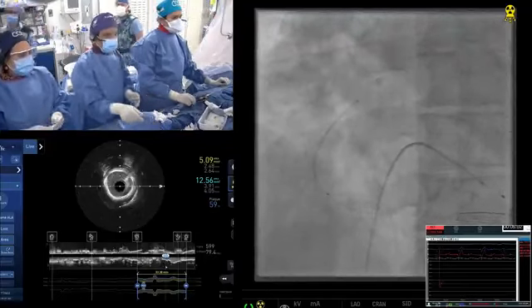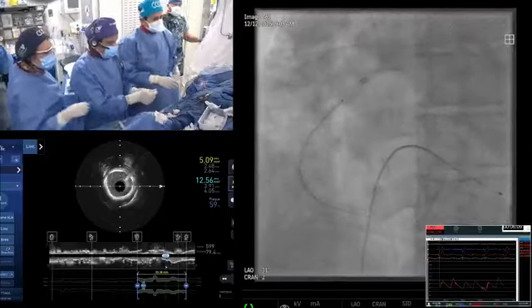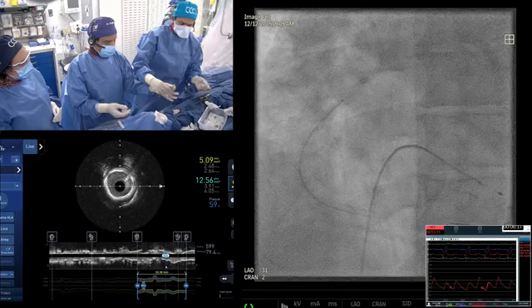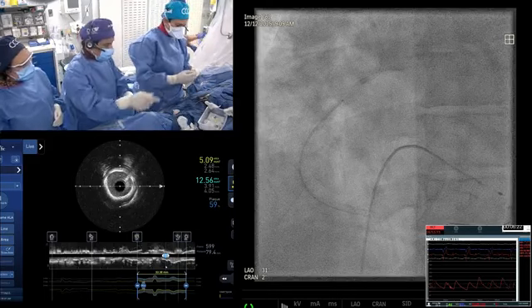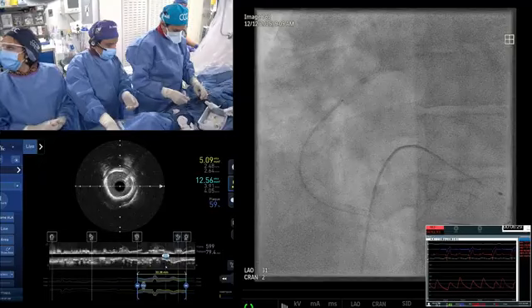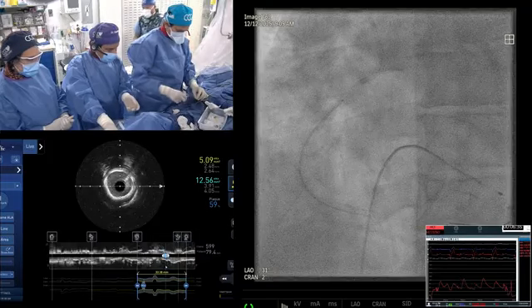The other thing is, do you need a guide liner? No, I think the filter wire will take it. Why don't we just put a stent? No, leave a little gap. Connect. No gap. Okay, he's saying that there is a disease, very small area even. You have to go on the filter wire. No, let's put this. You saw that, and even proximally there is no plaque, but the circular calcium. Yes, the whole vessel is calcified.